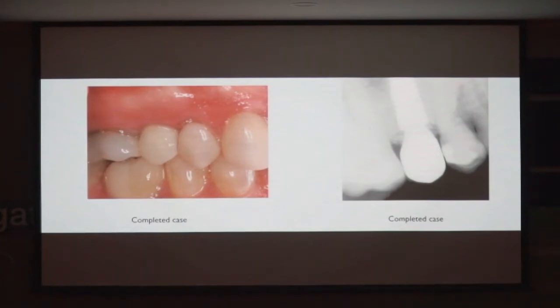And I can tell you the people in, Salama, Garber, a lot of people are talking about this. But it is really hard to do if you're not guiding. I couldn't do it. I wasn't good enough to figure those angles out, and I think I'm a pretty good surgeon. But with this, it doesn't take me long. I planned for one of these for about 60 minutes versus an implant, 45 minutes, because I have to plasty the root. And that takes me a little longer, and I use a microscope to do it. But I've lost no bone here.